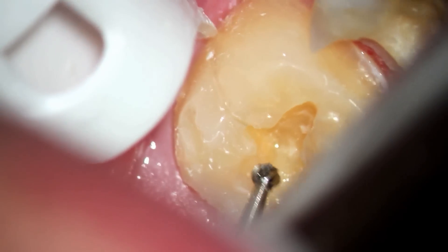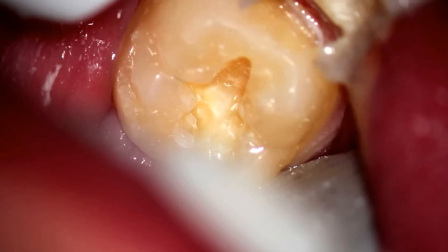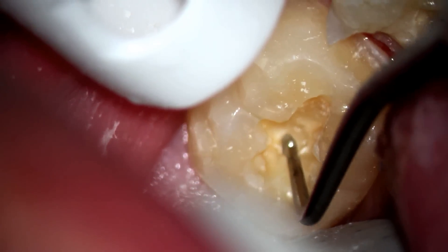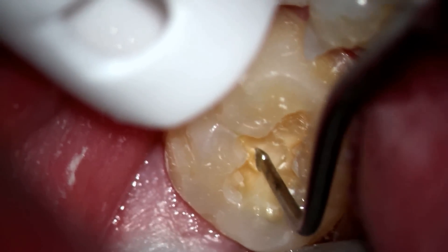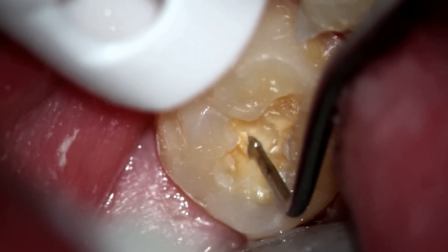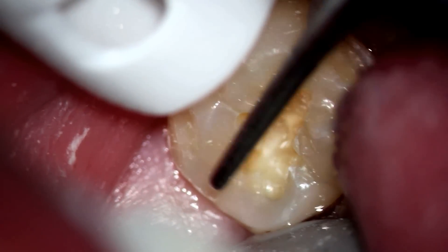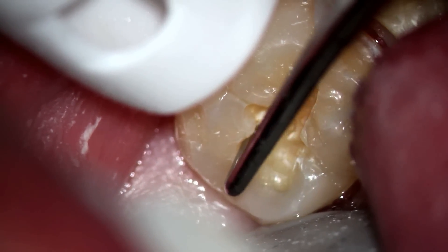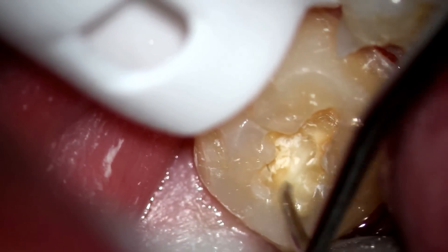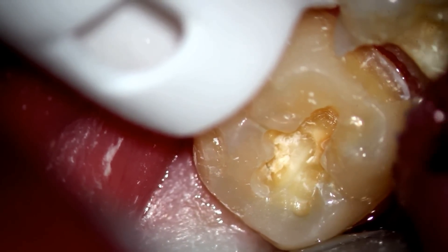You will see a little bit later how the decay is actually up underneath the cusp tip. We use a spoon to show that the decay is still there — it's very soft, and we're able to peel it out. Teeth are supposed to be hard, not soft, so we have quite a bit more work to do. It's possible that the filling may have had some decay left behind originally — that would be another alternative. It's also possible that the light didn't cure properly.